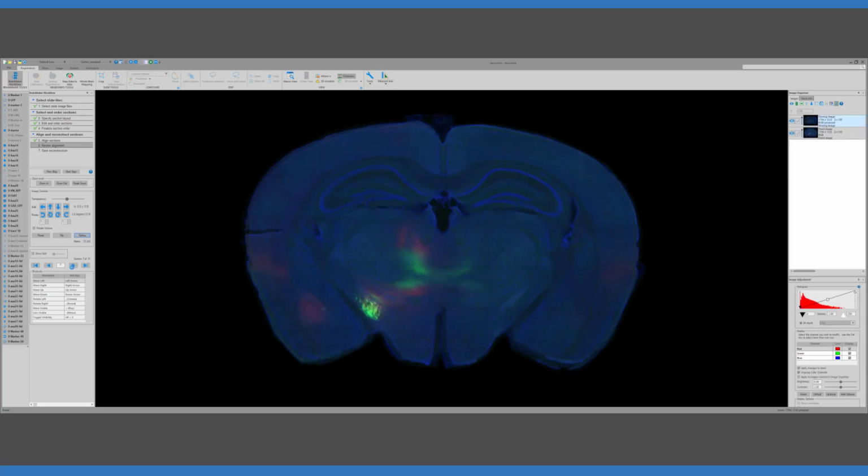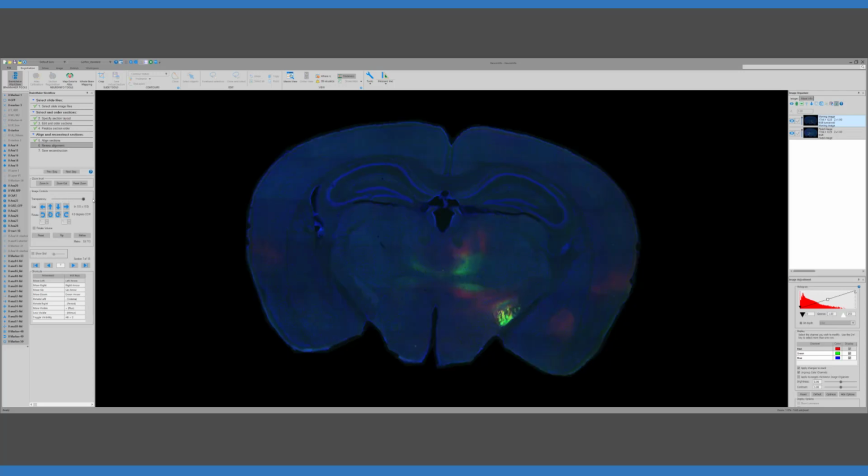And if you remember when we saw the whole slide images, you could see that those projections were on either side of the tissue as mounted on the slide. So I just unflip them. So this is the prior slide, and we're on section 7 here. And then say the next one was flipped, then we can flip it.